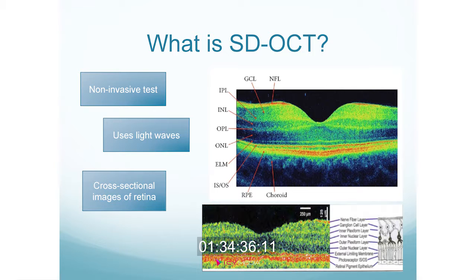We all know that OCT is a very easy test to do. You sit the patient behind a machine and you essentially take a photo. You can get multiple photos in seconds of time, which is always very nice. It's a non-invasive test, okay, so we don't have to worry about patients having side effects from dye or anything like that. Patients won't have anaphylaxis to the test. It uses light waves to essentially obtain a tomogram or cross-sectional image of the retina.